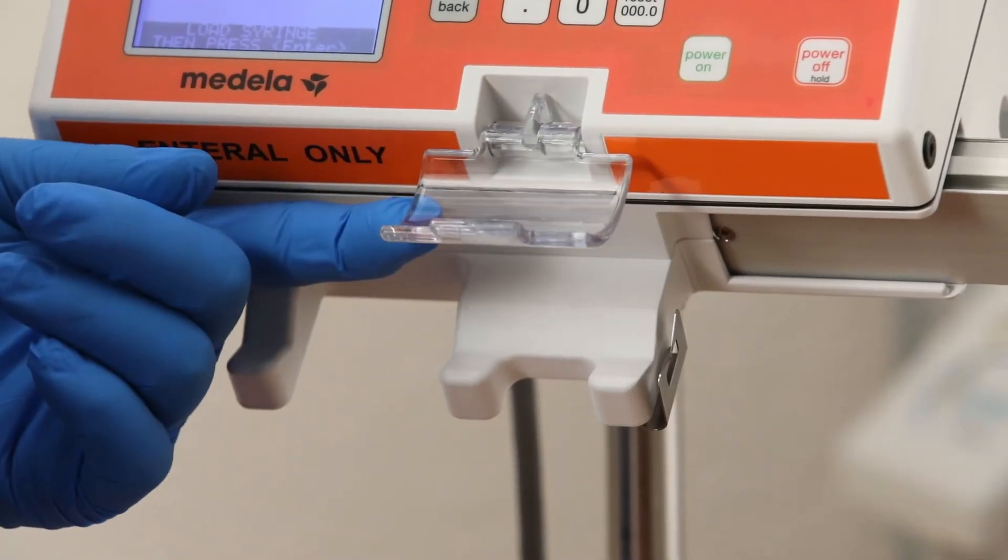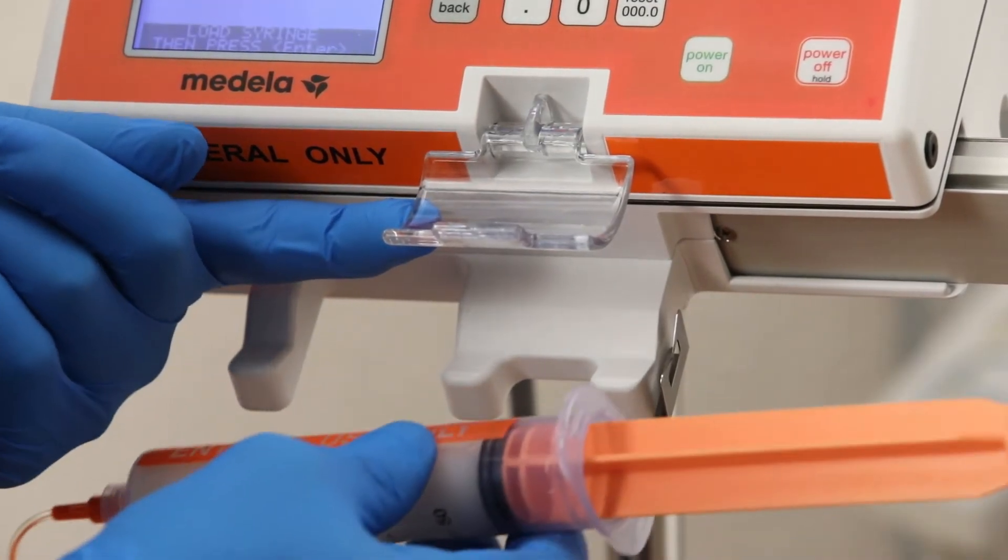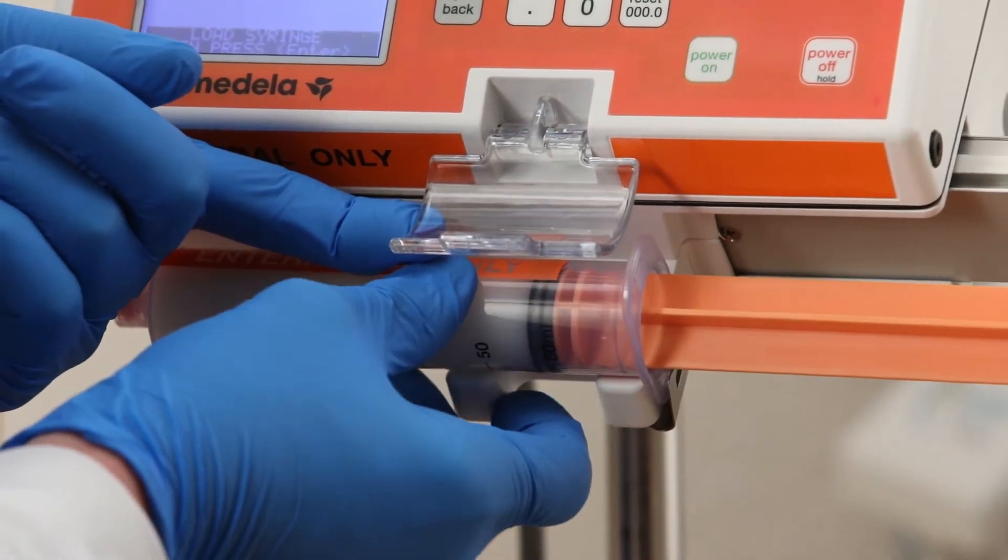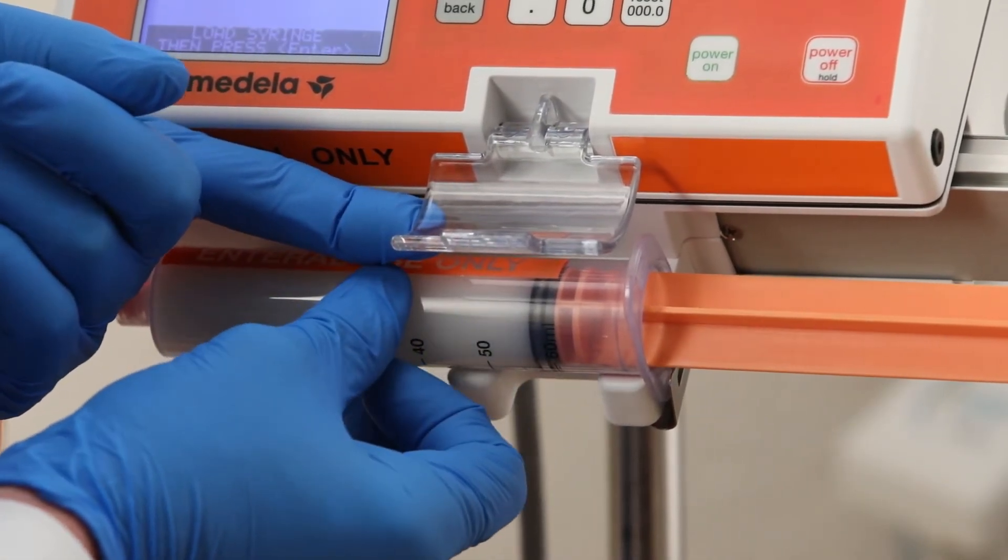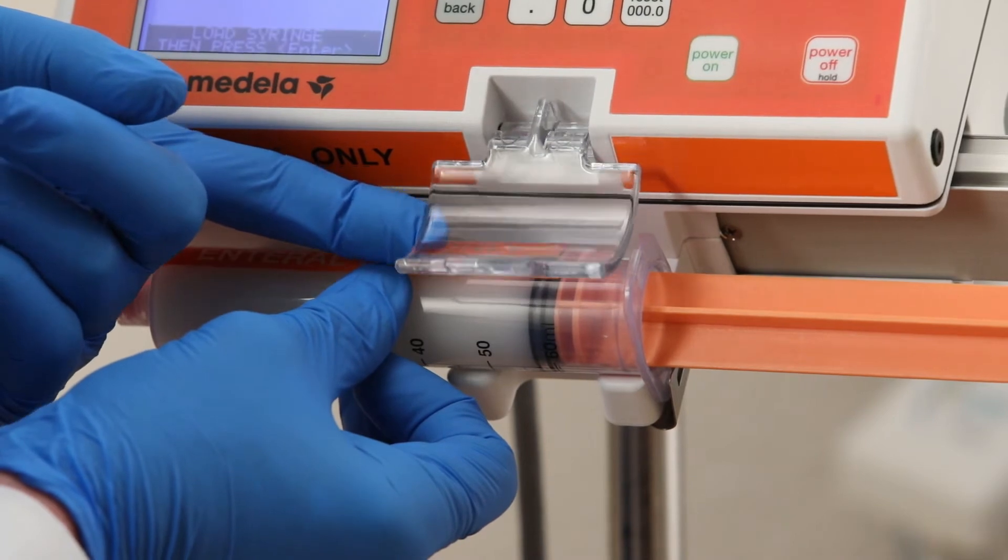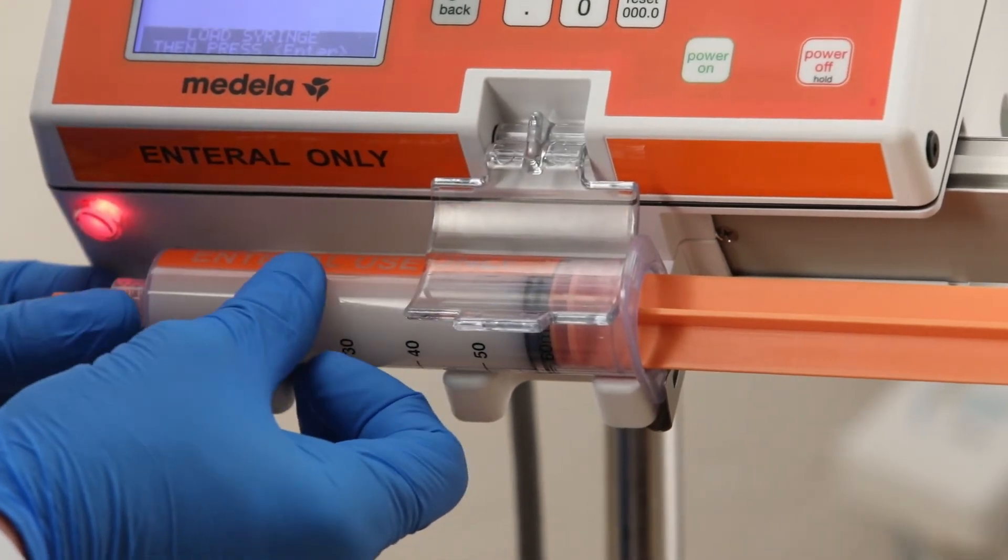Lift the clear syringe clamp allowing room to place the syringe. Insert the syringe barrel first. Ensure the barrel is placed in the two notches under the clear syringe holder clamp. Then lower the clear syringe clamp.